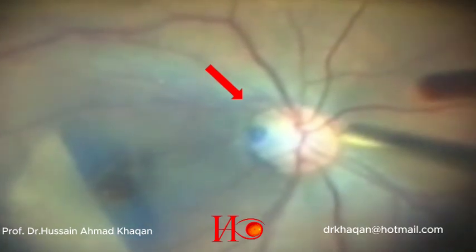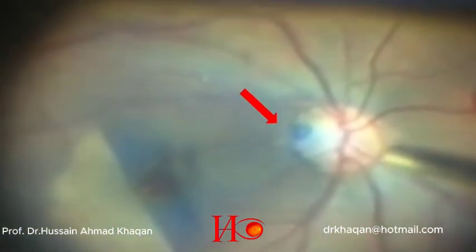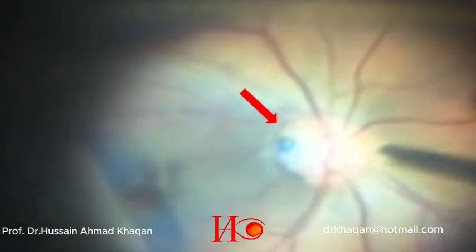Here you can see that with the fluctuations of fluid, the vitreous plug sucks in and sucks out. This is a very important and new finding.